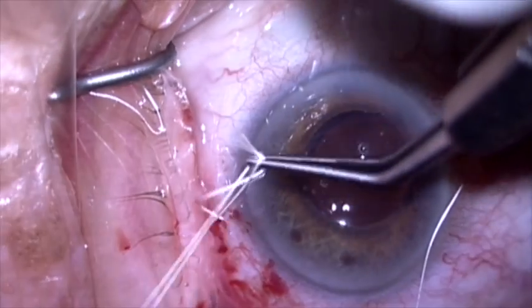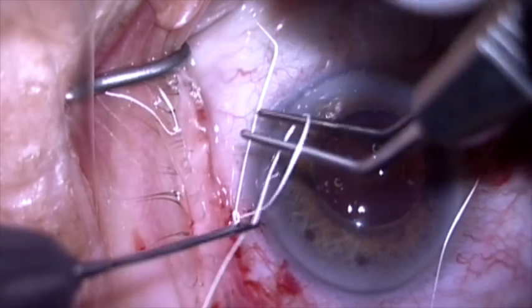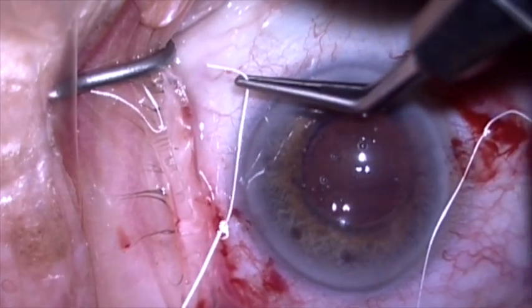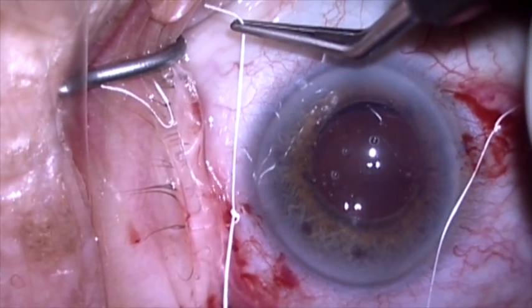I can then adjust the tension on both sides. You really do not want to make this too tight — you want it just enough to hold things in place and no more than that.